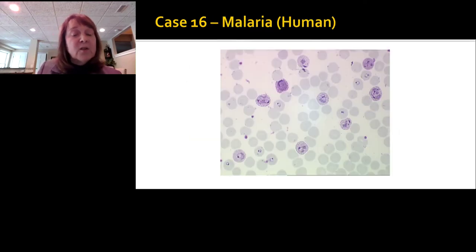Malaria is one, particularly if you're working in monkey colonies, and you know that we have malaria there. But you could have babesiosis, you could have a number of different parasites. It's important to remember that these parasites can have very large nuclei in them. They indeed can stain with this DNA stain, so they can be seen as another separate population. And also these parasitic infected cells sometimes are kind of lysis resistant. Because of that, we see larger debris populations.